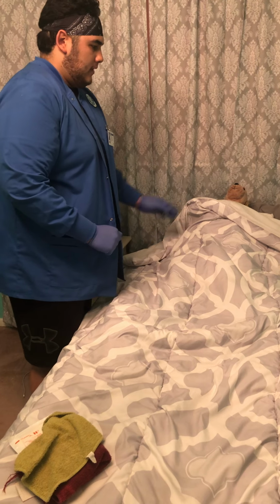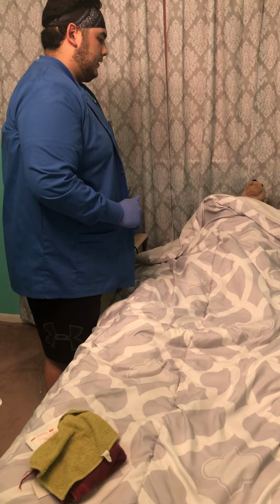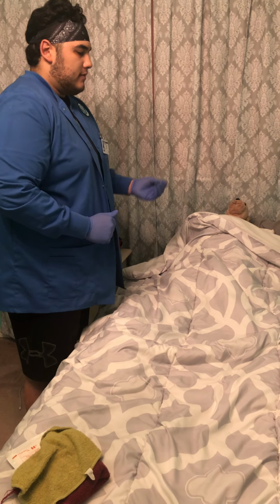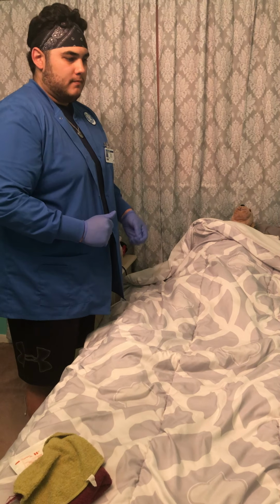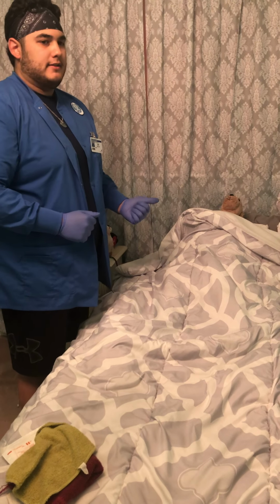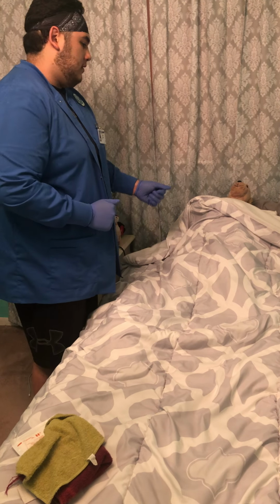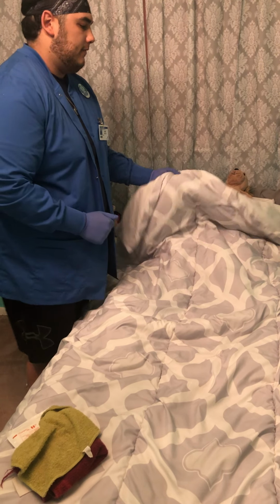And so, now that we've gathered the supplies, we want to go ahead and we're going to raise the bed into a comfortable working position, as well as the bedside table. And then we're going to put the patient into a dorsal recumbent position. So what we're going to do is we're going to lay her flat.